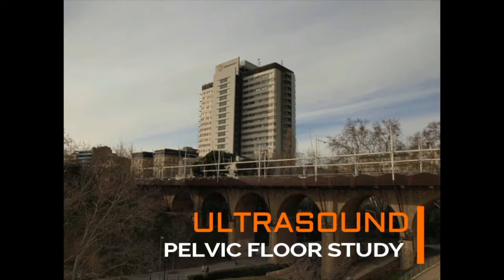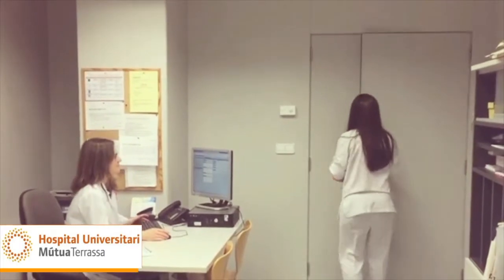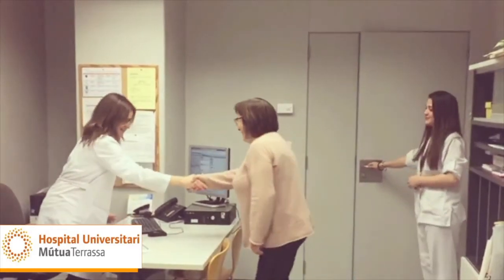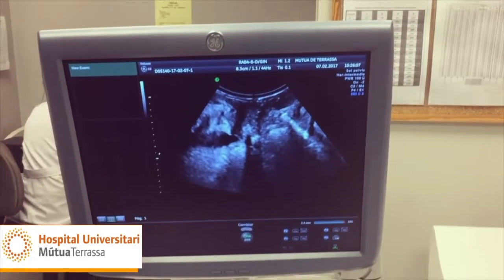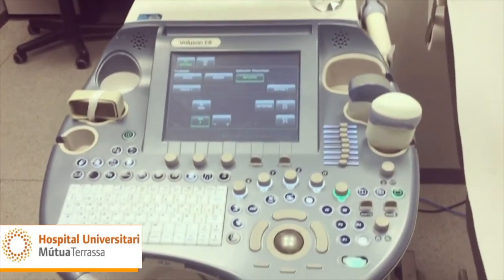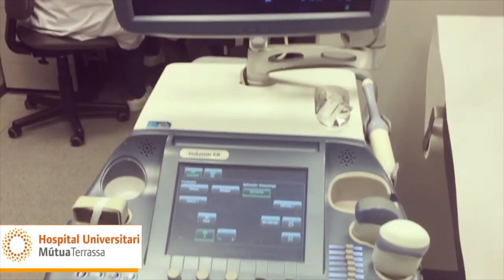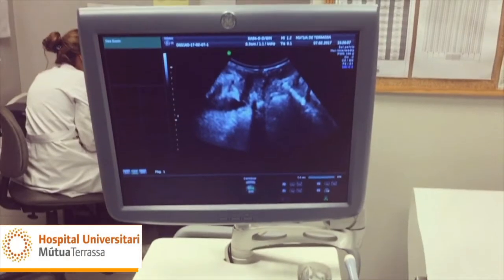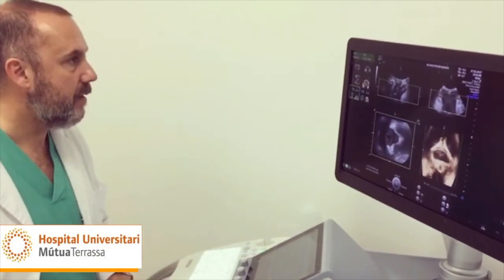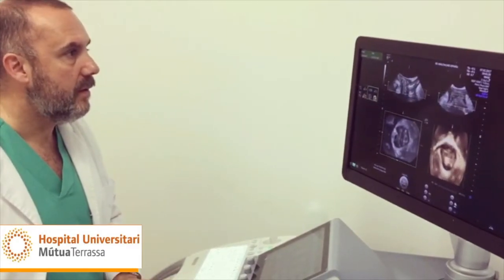Pelvic floor dysfunction has a high prevalence. In recent years, ultrasound has become a very useful tool in the diagnosis and follow-up of this condition. The introduction of three-dimensional ultrasound has allowed visualization of the axial plane of the urogenital hiatus, which previously could only be seen on magnetic resonance. The safety, cost, and ease of performing a real-time dynamic study have made ultrasound the imaging investigation of choice for the study of pelvic floor disorders. This video aims to facilitate image acquisition methods and bring this technique closer to professionals with an interest in this field.